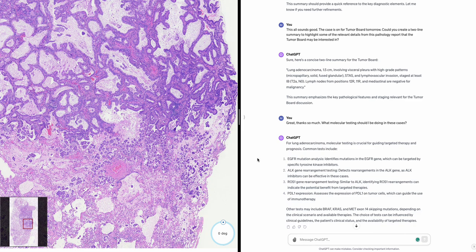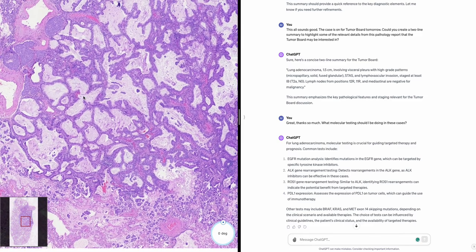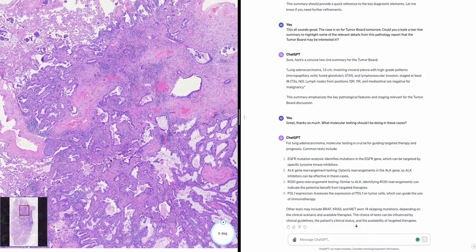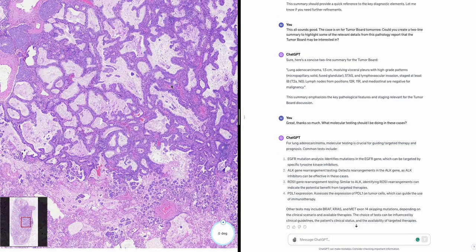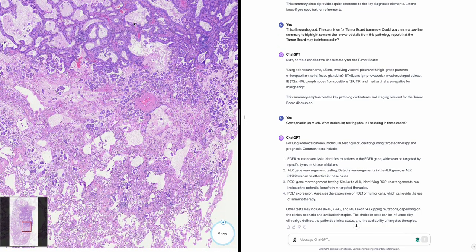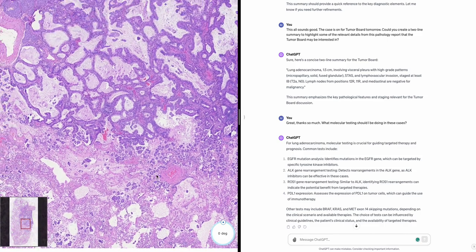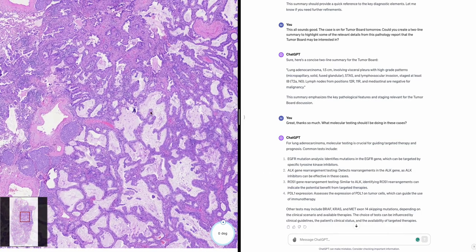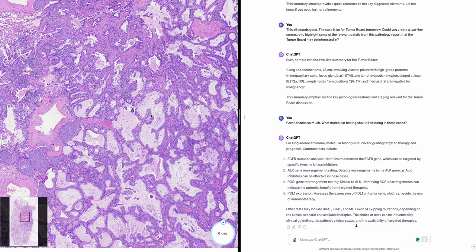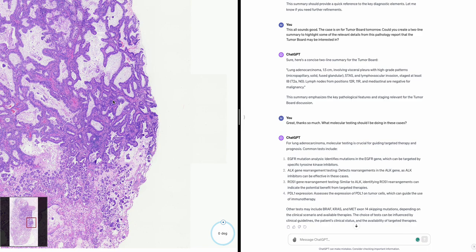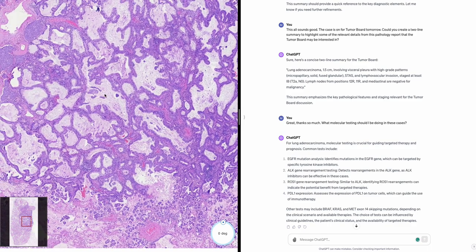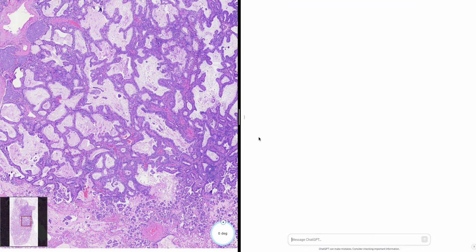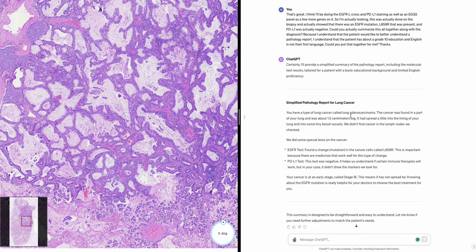Could you summarize all this together with the diagnosis for the patient? The patient has about a grade 10 education and English is not their first language. Certainly — I'll provide a simplified summary of the pathology report including molecular test results tailored for a patient with a basic educational background and limited English proficiency.